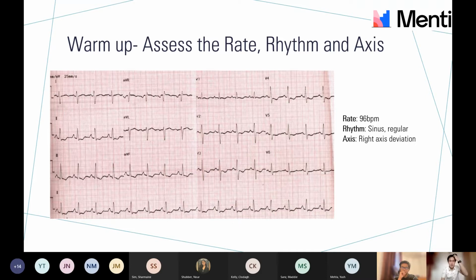Okay, I've started a 30-second timer because a few of you have got your answers in, which is great. Keep them coming in. The best way you're going to learn from this presentation is from actually doing the stuff and seeing if you make mistakes or you're rocking it.